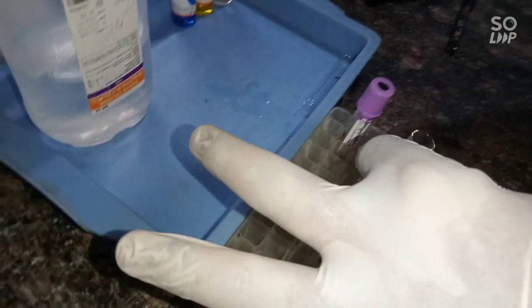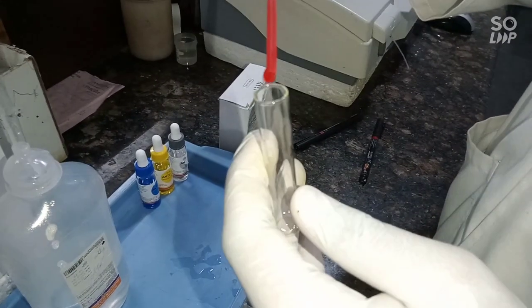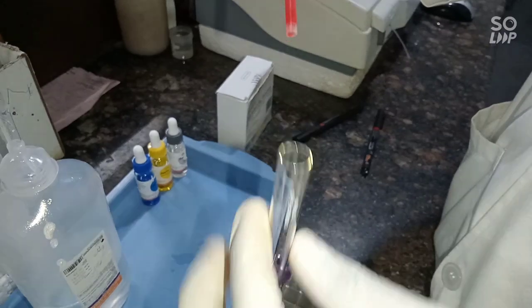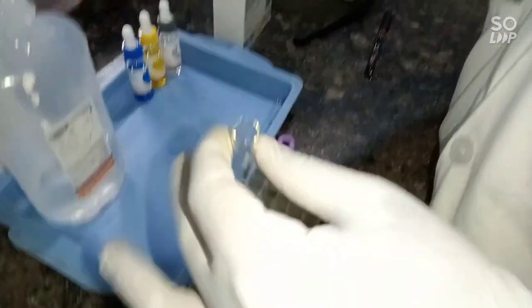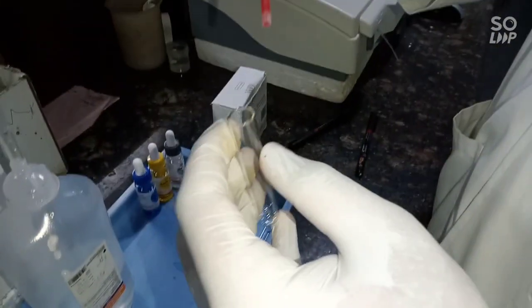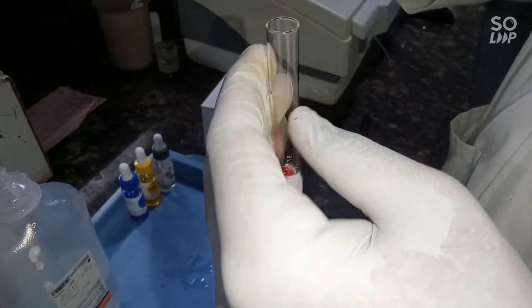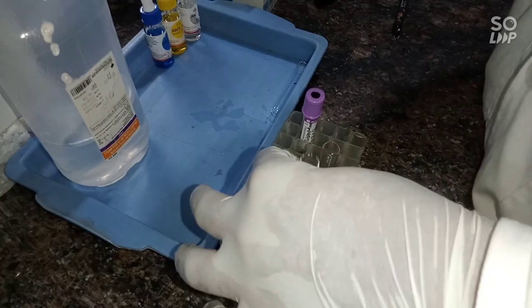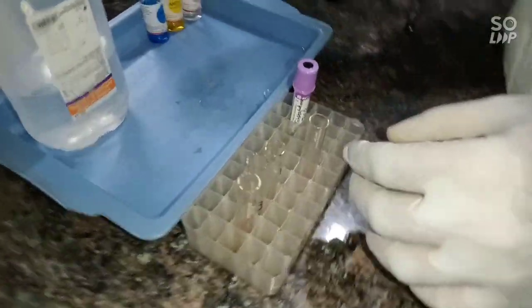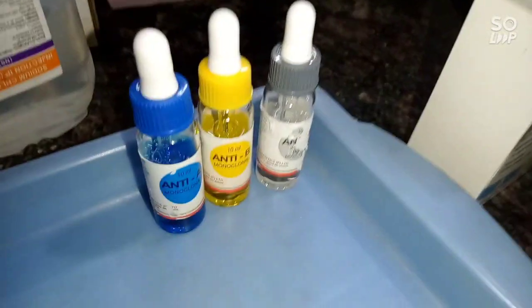If the patient's hemoglobin is low, you can add one drop more to the tube. Then add one drop of antisera to its respective tube.